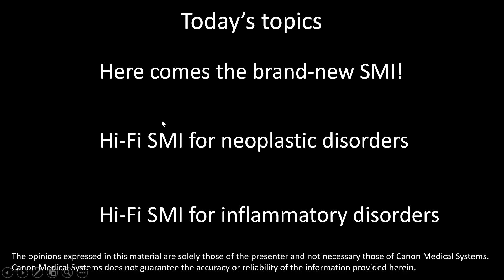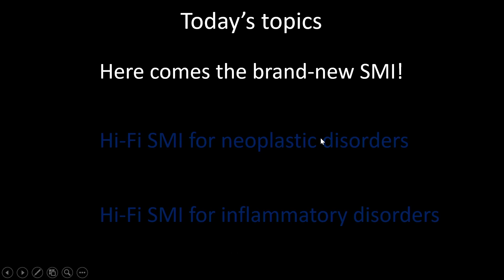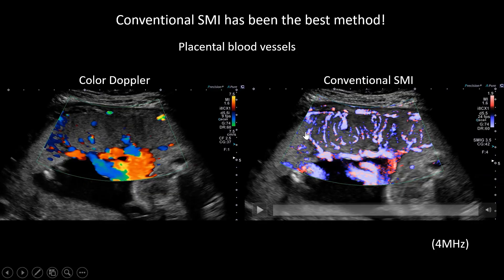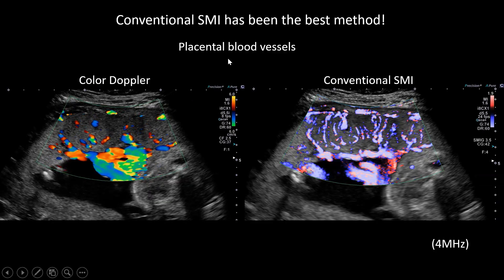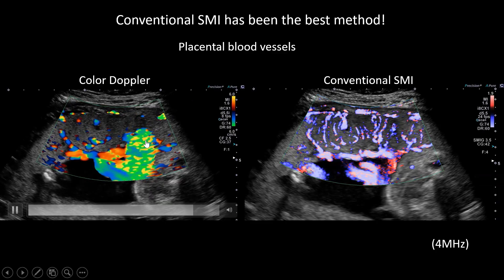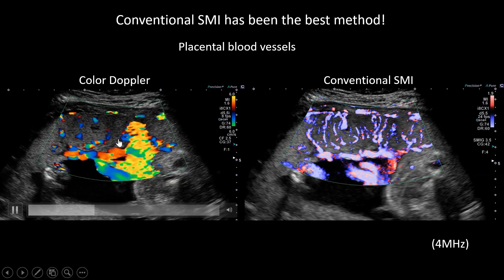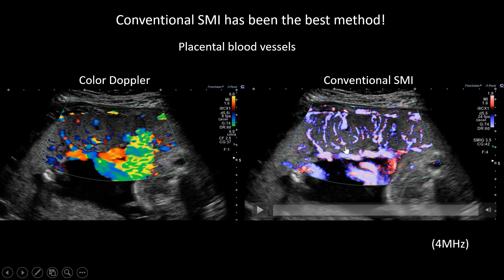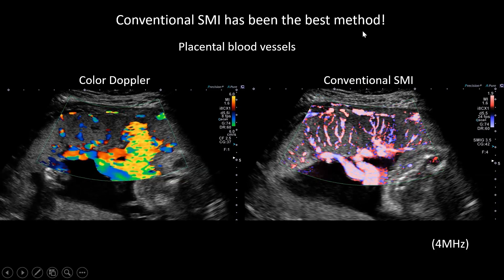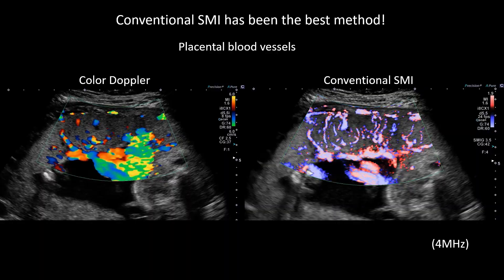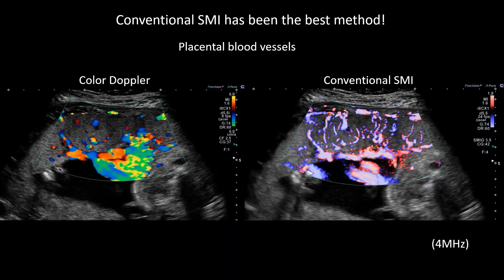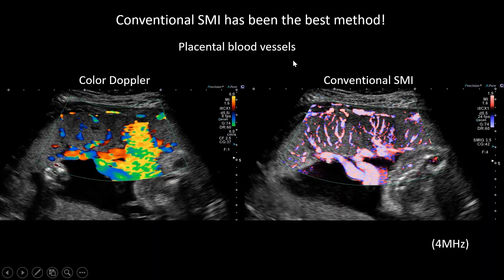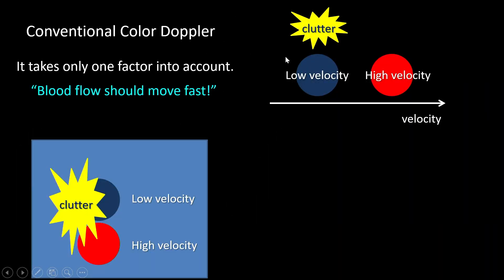Conventional SMI has been the best method so far. This shows the placenta and blood vessels by color Doppler — not so bad, you can see some of the vessels. But using conventional SMI you can see a lot more vessels in detail. I thought this was good enough.